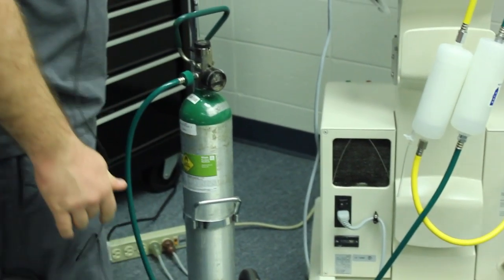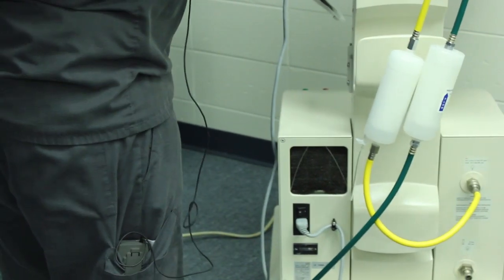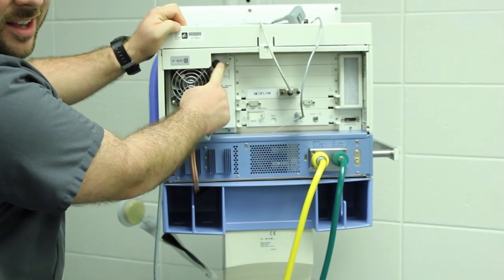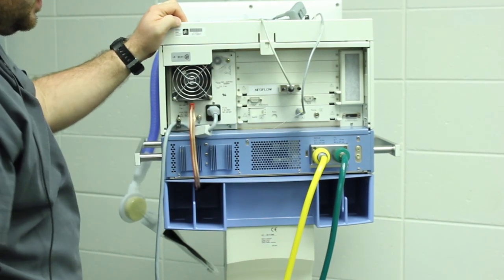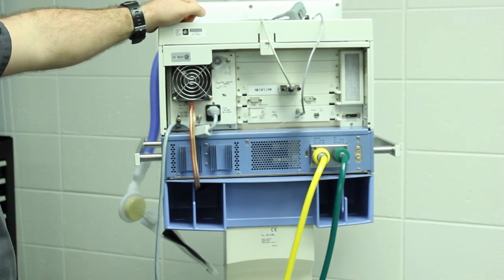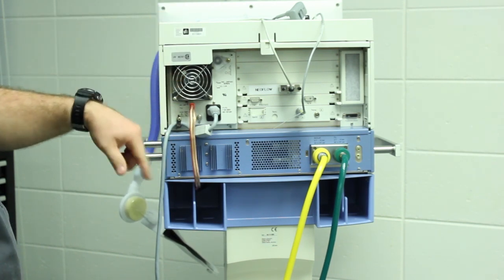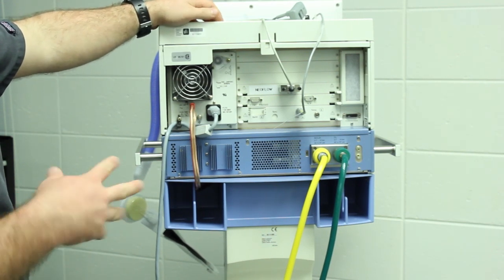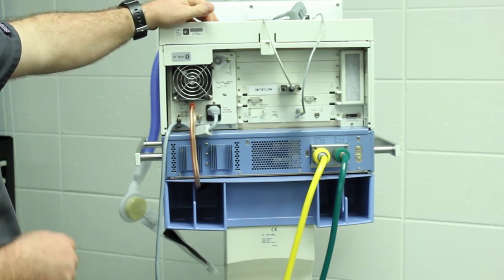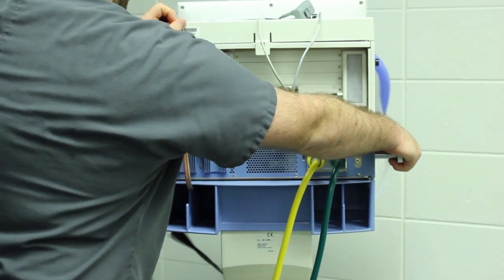With air and oxygen hooked up and the compressor going, let's turn the ventilator on — push this little flap up right here and turn it on. It has an initial somewhat annoying alarm — that's okay. It also has a cooling fan which can get dirty over time. If it gets really dirty it can start causing issues, so bring in some compressed air and spray it out to keep that fan clean.